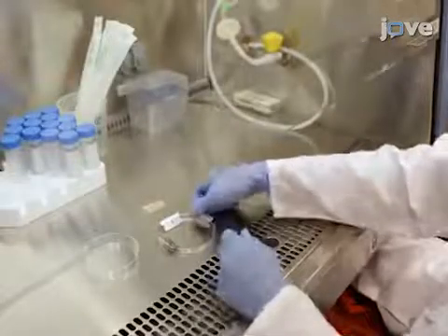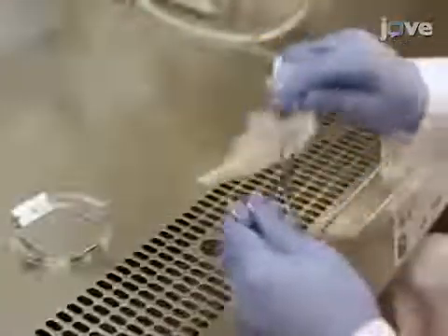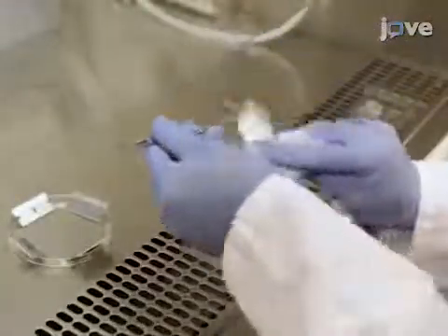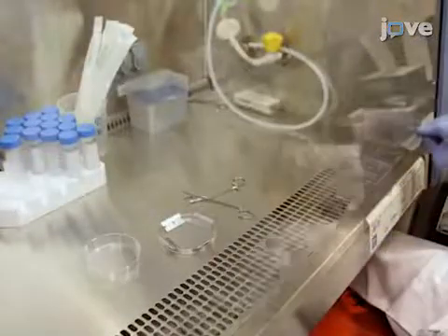Prior to sample preparation, sterilize the tissue culture hood along with razor blades, curved hemostats, and other non-sterile tools under the UV light for one hour, and perform all of the following steps under sterile conditions.